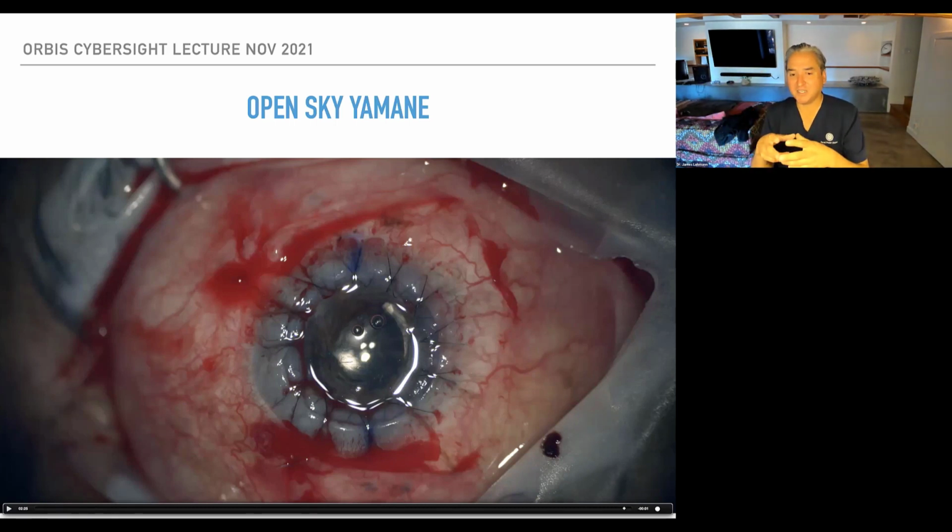Plus the pupil dilation, for whatever reason, when you open up an eye, it kind of comes down a little bit. It's just not the easiest thing. You can do it. You can even phaco it. I've seen doctors use a phaco, but to me, it's overkill and not needed. A CCC can be done, and I have done it before. I just find it's not the most efficient use of my time when the eye is open.